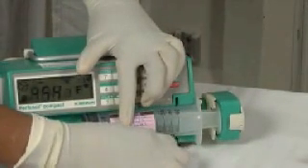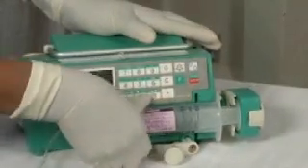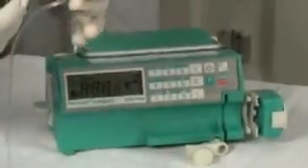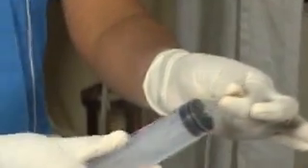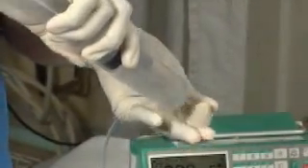Remove the syringe by unlocking the two locks and gently pushing the syringe out of the pump. Remove the connector by bending the tube between your fingers to prevent leakage and then pull it off. Keeping the tube bent, insert the connector into the new full syringe like this.